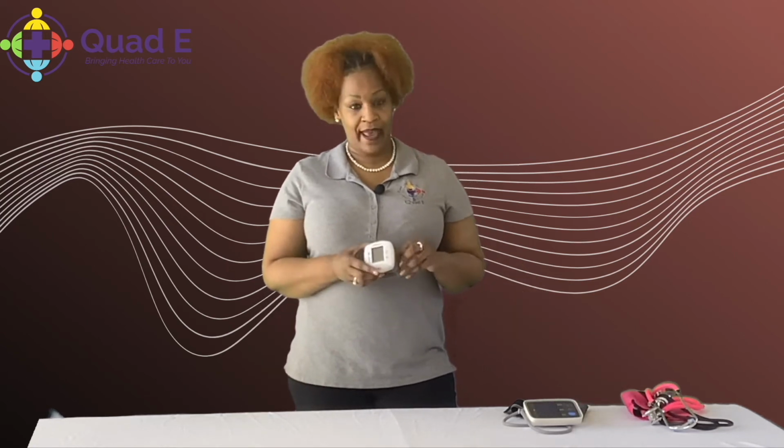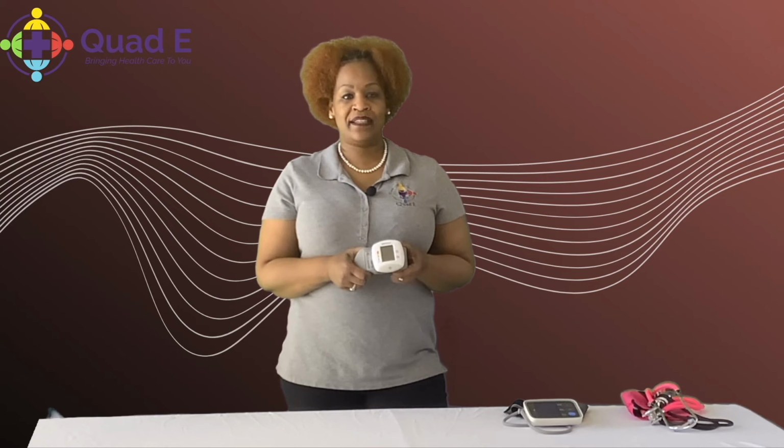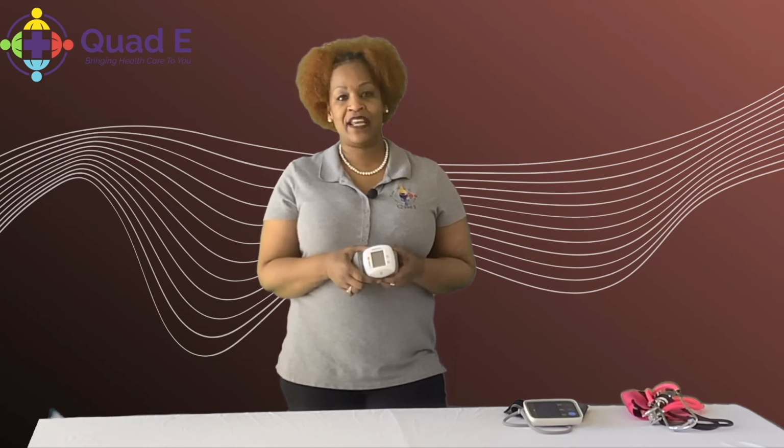First, we have the one that goes on the wrist. All right, this one is not recommended by the American Heart Association. So if you happen to have one, see if you can check with your insurance company or speak with your doctor to make sure that you get one that is a little bit more accurate, okay? If you don't have anything else, use it, okay?